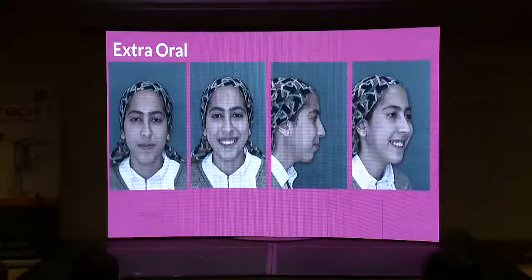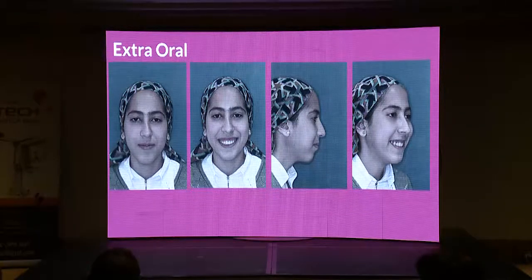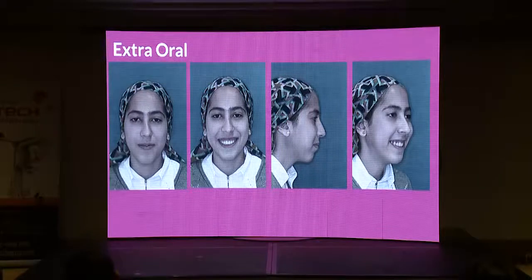The extraoral photos were all aligned and perfect. The increased gummy smile was because of the increased vertical height of the case and the growth of the mandible downward and backward, which was compensated by growth of the maxilla downward. This was discussed with the patient before treatment, that she might need a surgery to correct her gummy smile because she had longer incisors and we cannot go for gingivectomy or such things. And the patient was happy and agreed to end treatment.